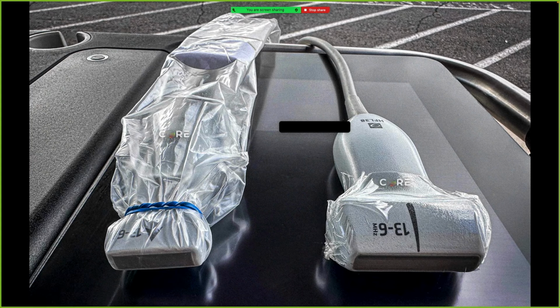So curvilinear otherwise. Now, with regards to sterile sheaths, this is something that is debatable, but I'll tell you what I do. If I am doing a peripheral block, so forearm or calf down, I generally am just using a Tegaderm, a sterile adhesive dressing, and sterile gel. I always use sterile gel. But if I'm doing anything more proximal to the knees or elbows, I'm just going to put on a sterile sheath. It doesn't take that much work, and if it decreases the incidence of something major happening, even by 1%, for me it's not that big of a deal. Plus the probe itself is cleaner, and it's easier to clean up.